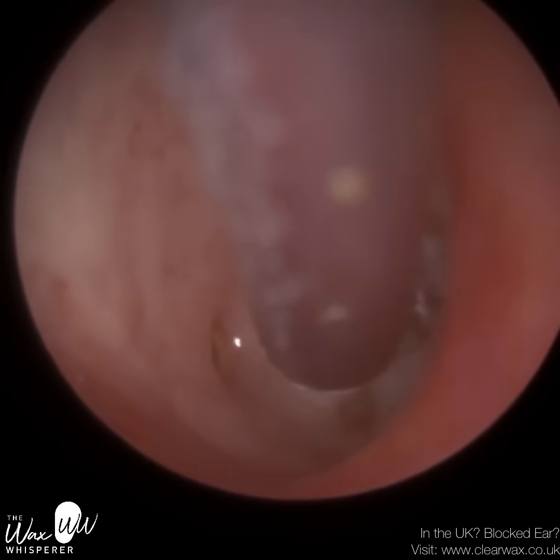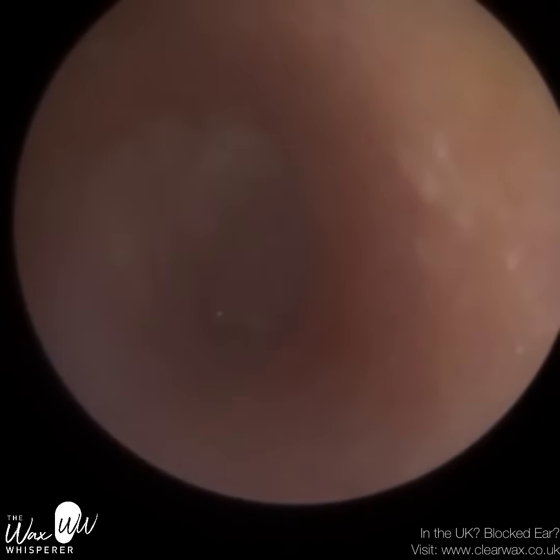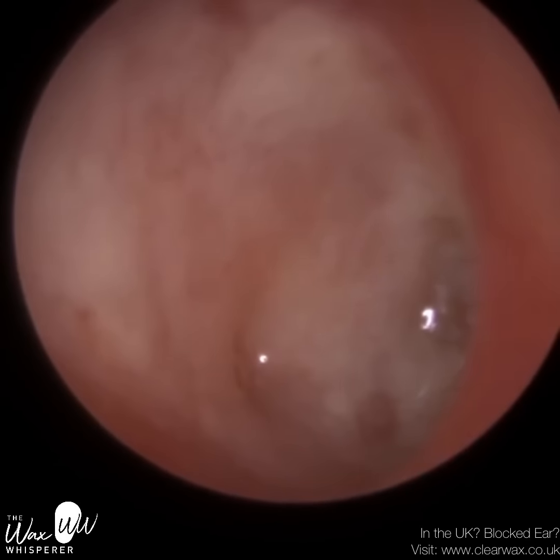That's fluid bulging the eardrum out to the right. And then to the left, you can just see it's pumping away. So I was just trying to get it as dry as possible. So there's that little hole. Well, you can see it just beating away.